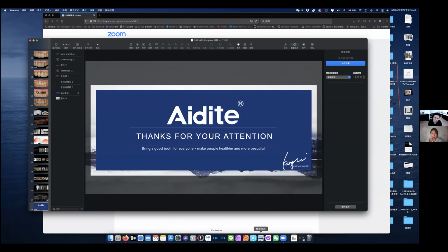I recommend you choose the original standard abutment or their official ti-base, because outside the crown you can choose any brand, and maybe I like to edit the product, but the contact and the interface and the ti-base are more important, because later they will affect the implant survival rate. So please, the ti-base is very important. Please try the right and good quality.